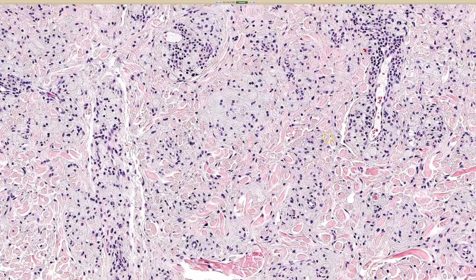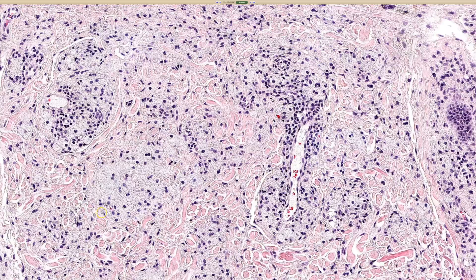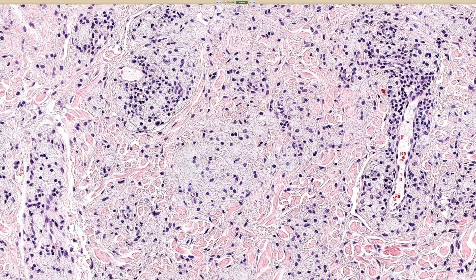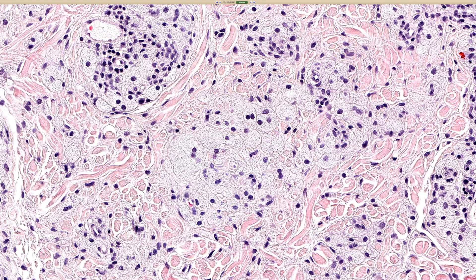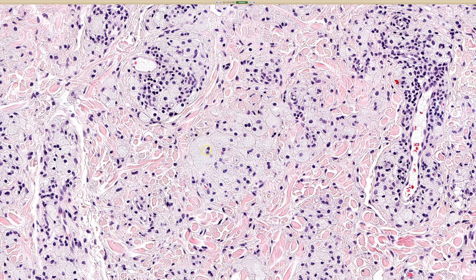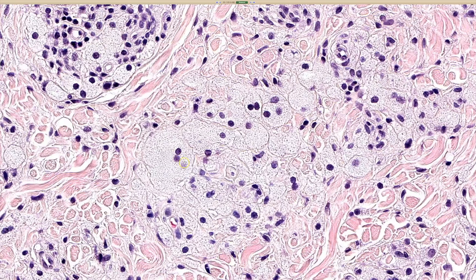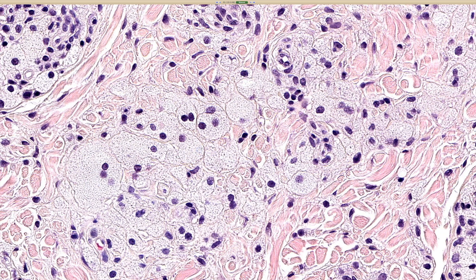And then here are the cells that are in the dermis. Those cells, you can see they're kind of vacuolating — it looks like there's some lipid inside. This would make you think of xanthoma cells. They're foamy histiocytes, histiocytes that have little bubbles of lipid in them.